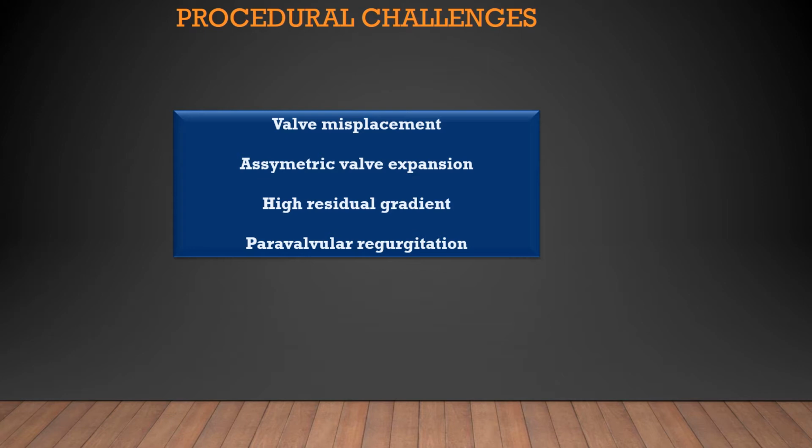Asymmetric valve expansion is certainly a concern. High residual gradients are known to happen and something that we need to understand and know about. Paravalvular regurgitation is certainly a big concern, especially when we start talking about lower risk patients.